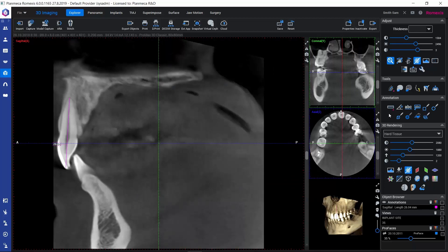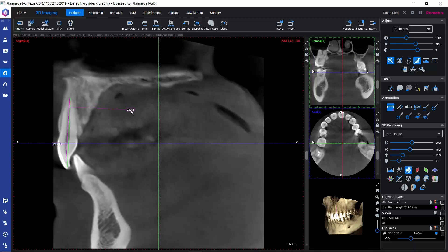Now let's do a measurement again, and this time we're able to freely determine where to place our measurement label — we could put it somewhere where it's not blocking us from seeing interesting anatomy. We place it by simply clicking with our left mouse button.